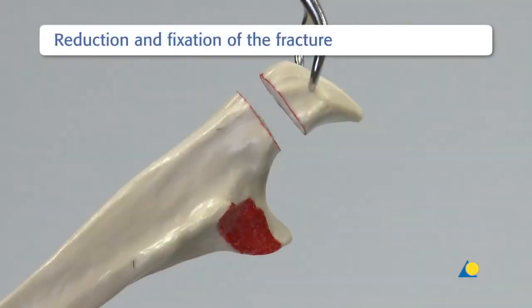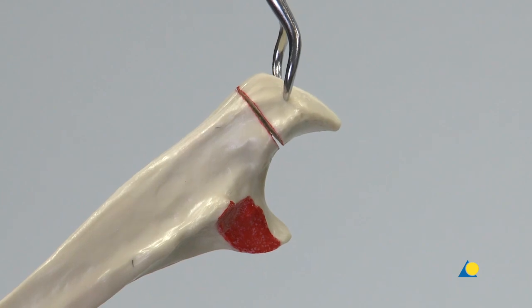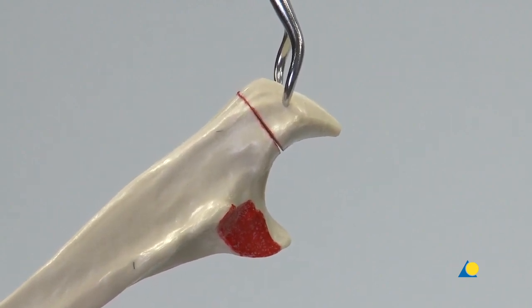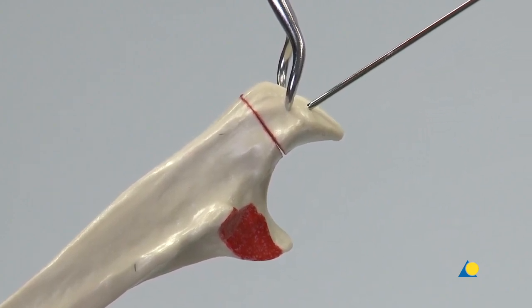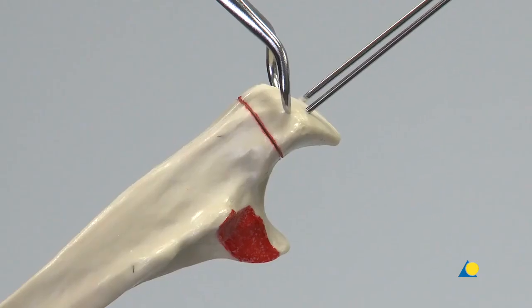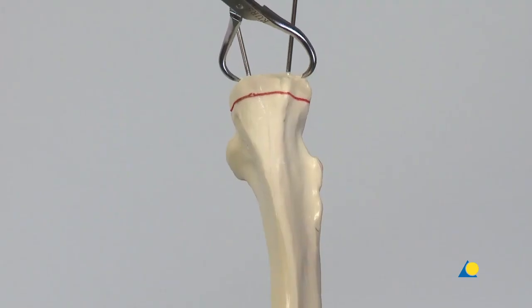Here is the fractured bone model. The proximal radio-ulnar joint is marked in red. The fracture is reduced with the help of the small pointed reduction forceps. The reduction is held temporarily with 2 K-wires. Make sure that the K-wires are inserted so they do not interfere with the planned position of the plate and the screws.